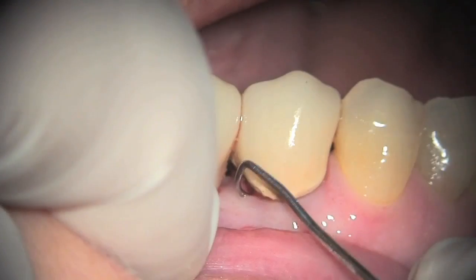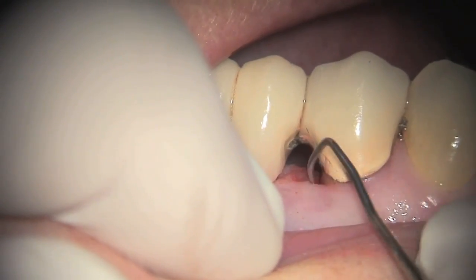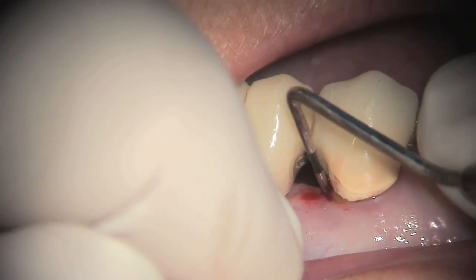Notice the over-contoured crown on this bridge. We are going to open up the distal interproximal area of this crown so that she can keep it clean. Notice that we have about a 7mm pocket in this area.